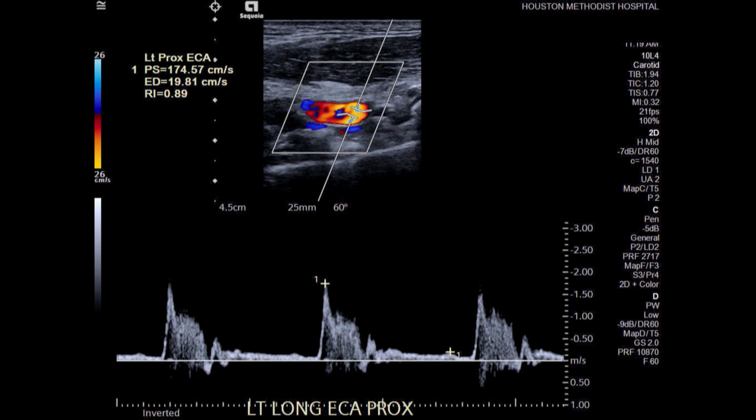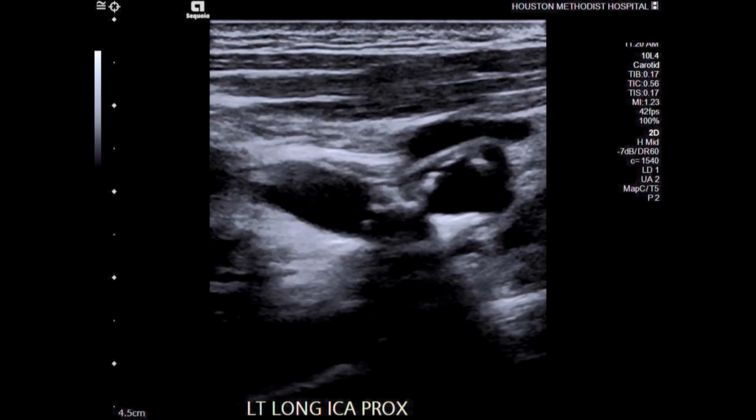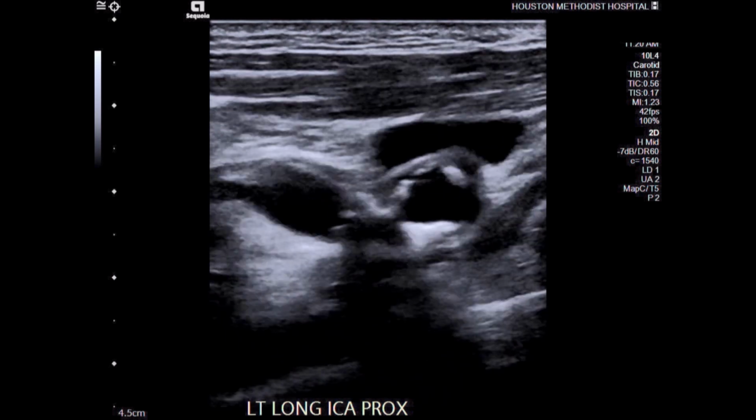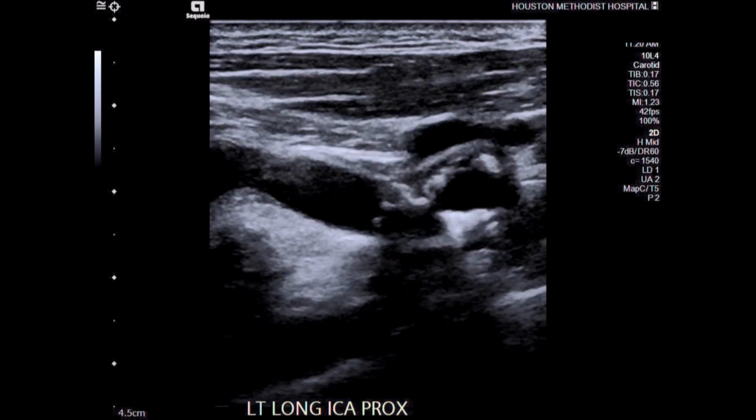So definitely we have to call it stenosis, but I hope that this is just one of the collateral pathways, that we can see the diastolic flow hopefully carry over some flow to the other side, and that's what the ECA was feeding, the opposite ECA, and giving those collaterals.